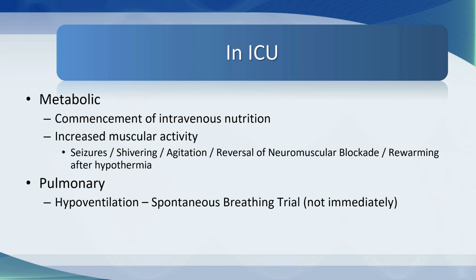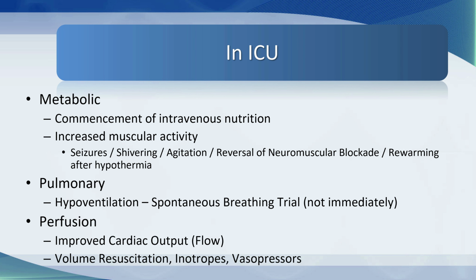On the pulmonary side of things, of course, with hypoventilation, when you put someone on a spontaneous breathing trial, you should keep a close eye on the end tidal CO2 because it just gradually increases over time as the patient hypoventilates, and it may be a reason to end a spontaneous breathing trial when you see a dramatic rise in the end tidal over half an hour, an hour and a half. Not immediately, of course. And then, of course, as I've mentioned before, overall improvements in perfusion associated with better cardiac output from volume resuscitation, inotropes, and vasopressors is associated with an increase in the end tidal CO2.